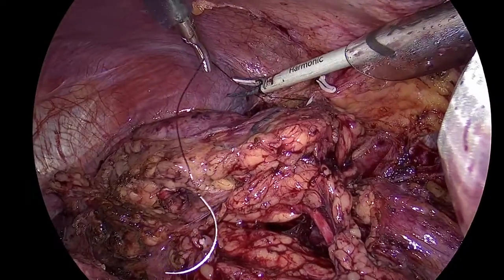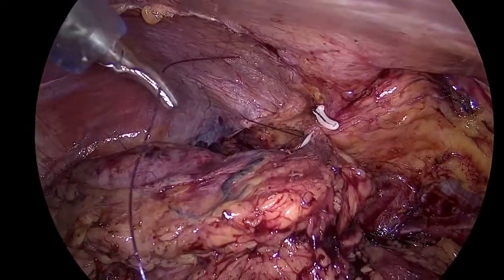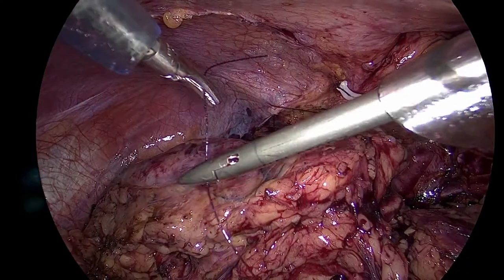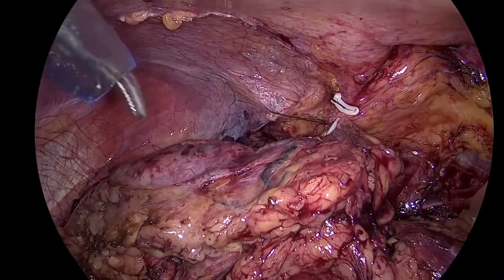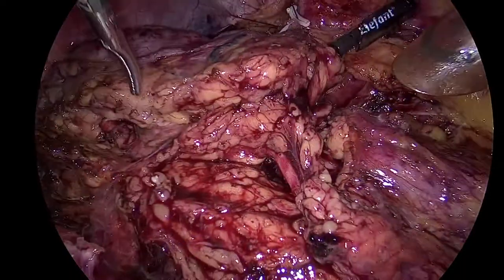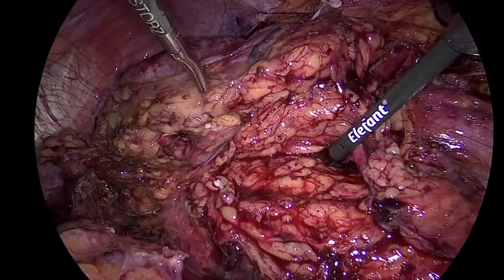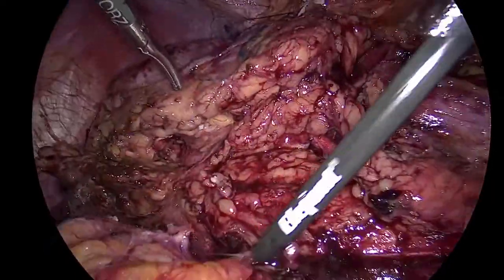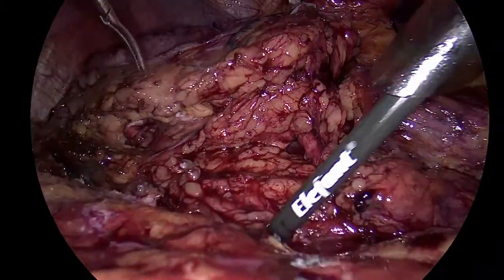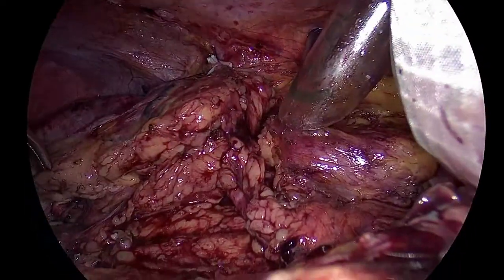I use the harmonic, as you see, also for cutting sutures because the scissors that we normally have do not cut the multi-use instruments. So if you start cutting sutures with them, give me the suction. I think we're fine. Good. Go back. Give me the drain, please. Will you remove the tumor? Okay, drain. Remember the pressure is 5, eh?